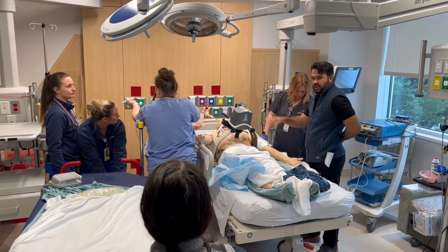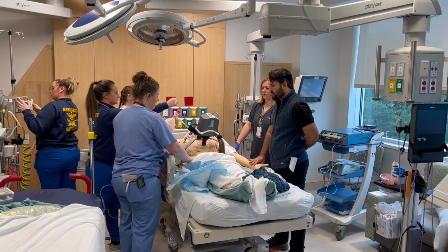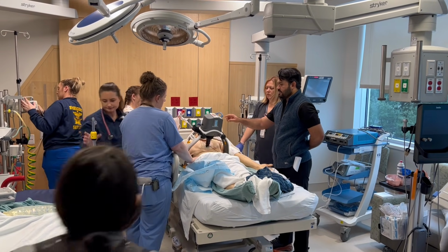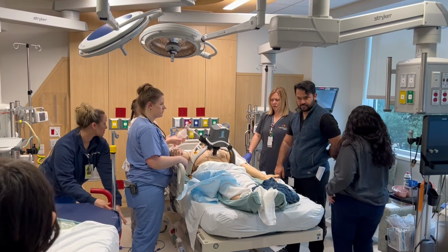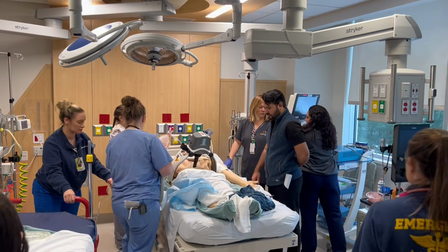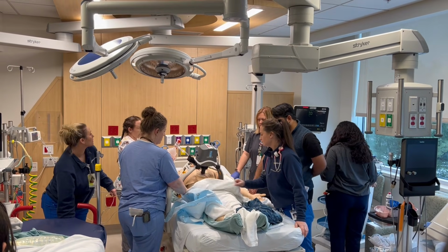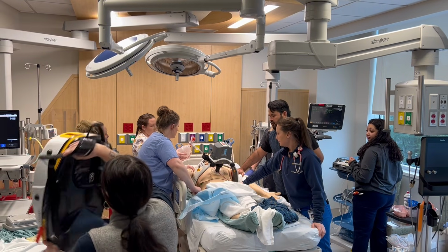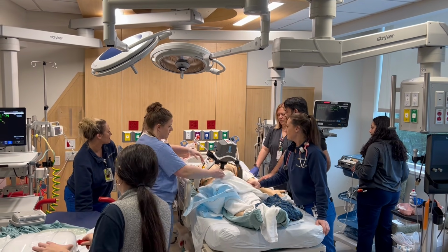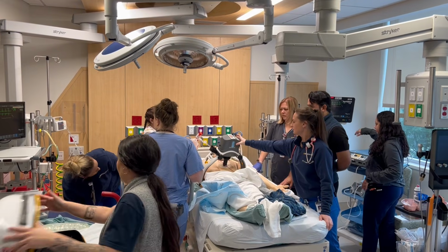Can we stop this for a minute and just check for the pulse and rhythm? There's no pulse. What's the rhythm? Okay, we have pulseless electrical activity, so we'll continue.